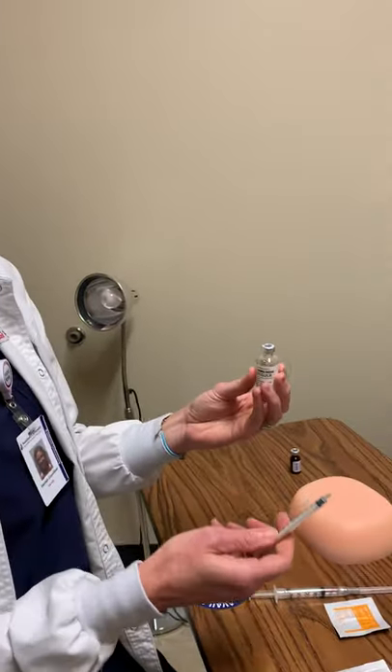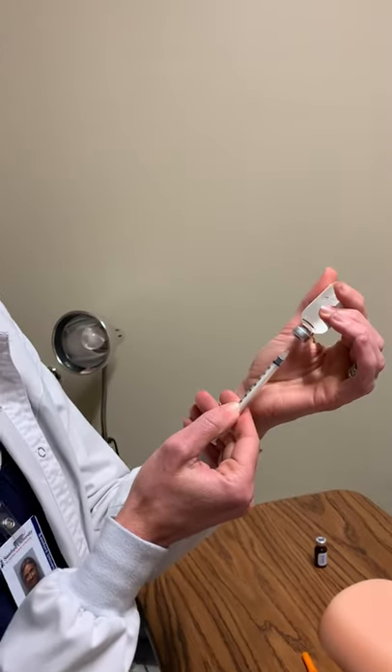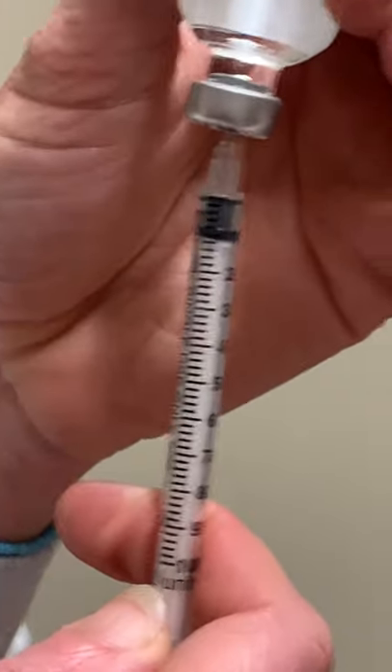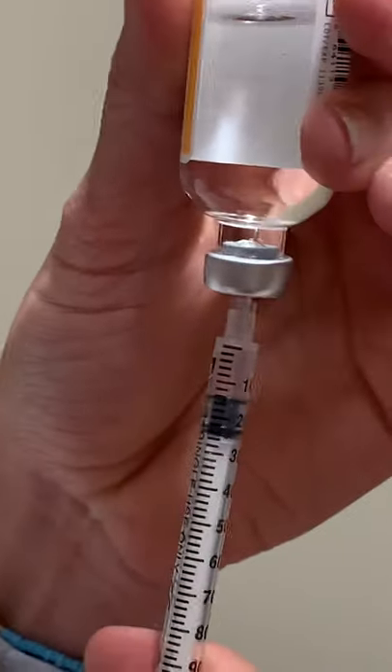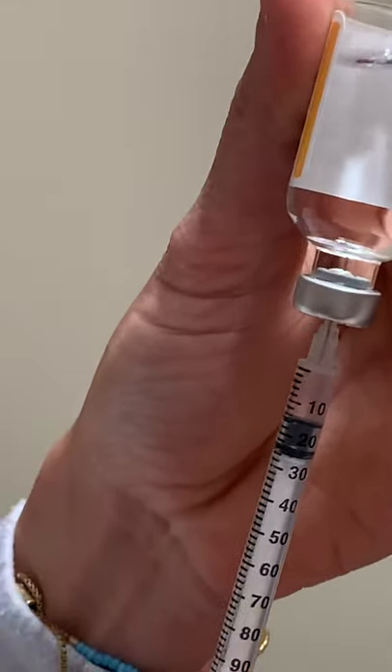I've wiped the hub and I've got my syringe ready. We're getting two units of insulin. As you can see, this goes all the way to a hundred units, so two units is really, really tiny. Remember, these needles are small, so just draw back as far as you need to make sure you have the correct dose.